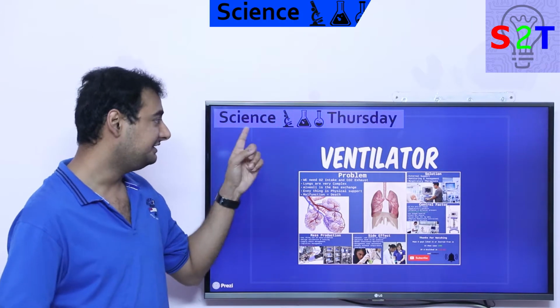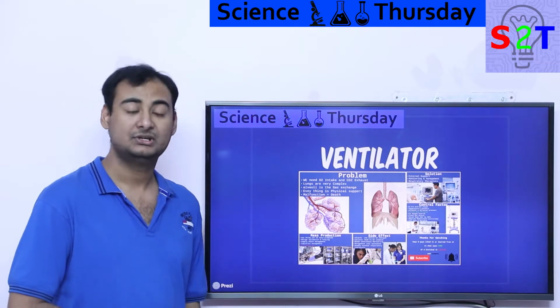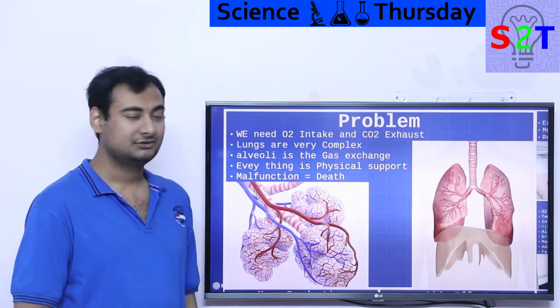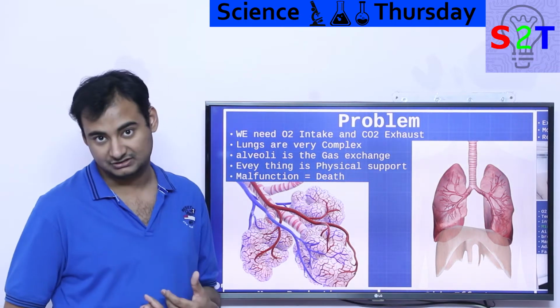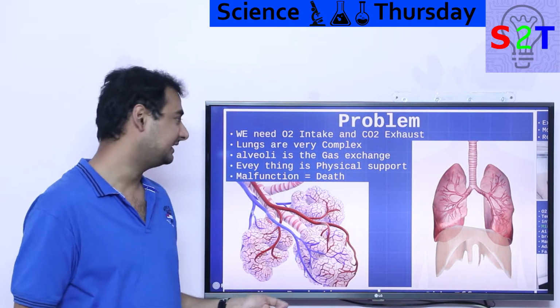In today's show, Science Thursday, we're gonna talk about ventilators. So let's dive right into it. Well, first you have to understand what our problem is. Our problem is that we need to take in oxygen, but we also need to exhale carbon dioxide.